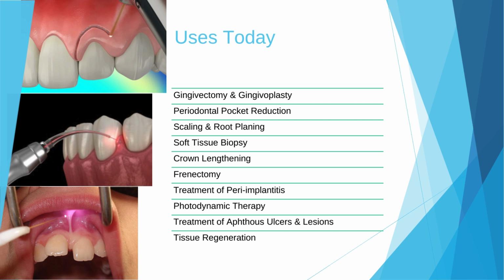Next is periodontal pocket reduction. The goal of laser-assisted pocket reduction treatments is to reduce bacteria and inflammatory tissue from periodontal pockets. This may facilitate the gum tissue's adhesion to the tooth surface and lessen the pocket depths.